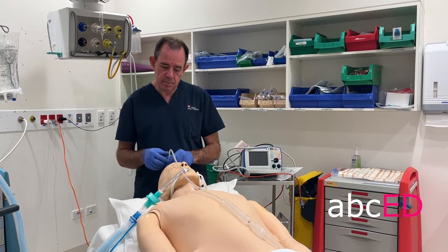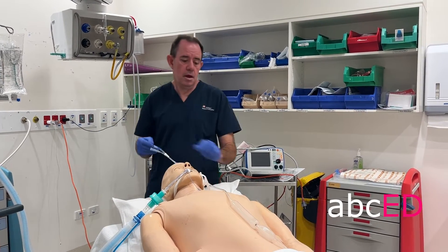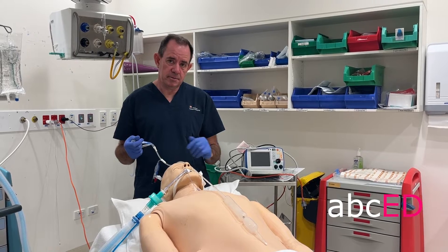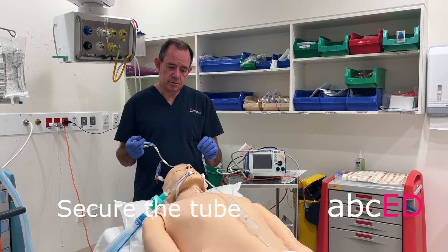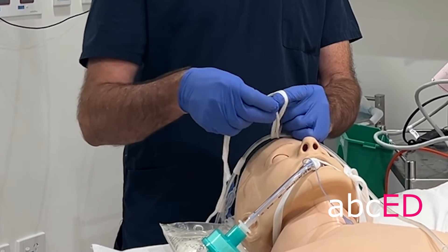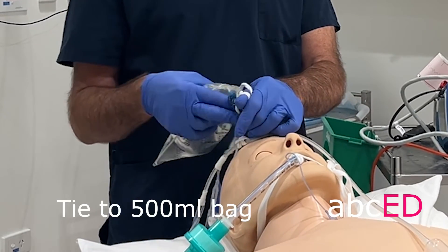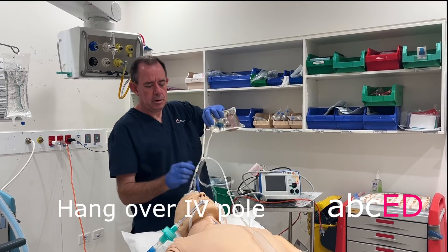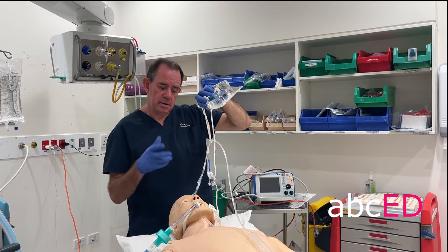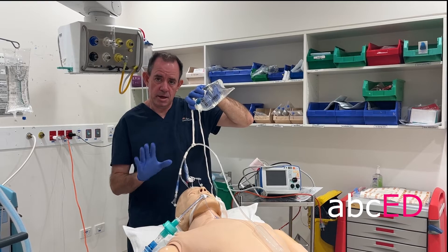Once you know the balloon's below the diaphragm, you can remove the guide wire from this particular tube, and then fully inflate the gastric balloon to 250 millilitres of air. In most cases that'll tamponade the bleeding from the varices. To secure the tube, make a tie around the tube, make a loop, and pass it through. You can secure that to a 500 millilitre bag of saline and hang it over an IV pole to provide traction on the Shen Staken Blackmore tube. Once that's in place, use the gastric suction port to empty the stomach — that may well have stopped the bleeding and you may have control at this point.